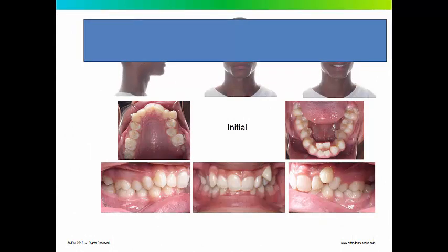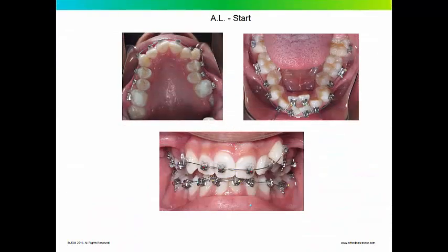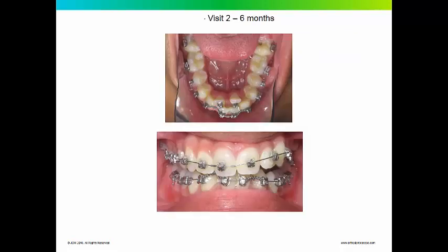This is a 17-year-old patient that a colleague of mine was kind enough to share. He treated this case non-extraction using an expansion technique. Let's take a look at what happened. Okay, here he is. This is showing some of the mechanics he's using. Starting to get things lined up.